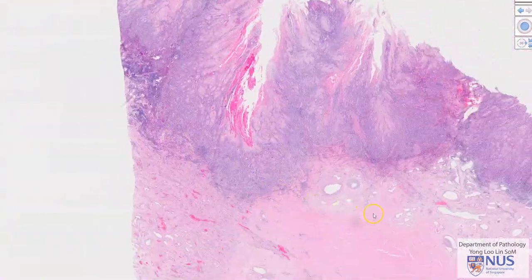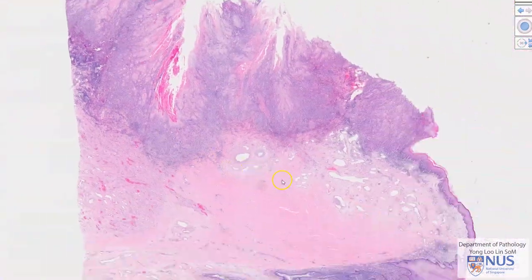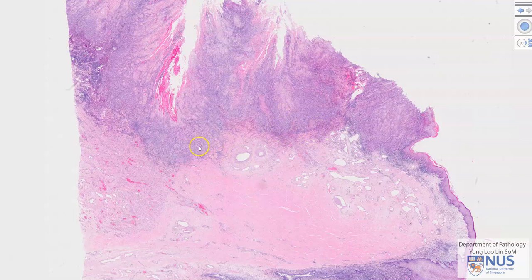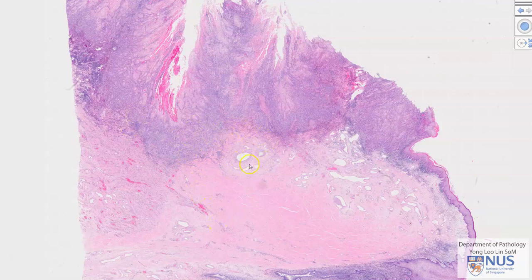Regarding the depth of invasion, we can see that this tumor is definitely invading into the lamina propria, and over here it is also coming just into the corpus spongiosum. So it is not a very deeply invasive tumor; it is relatively superficially invasive.